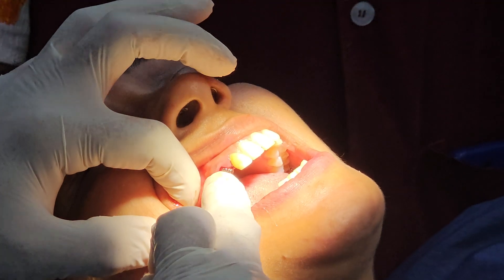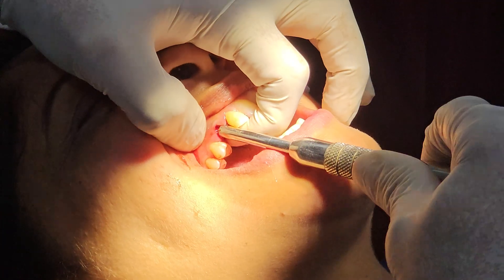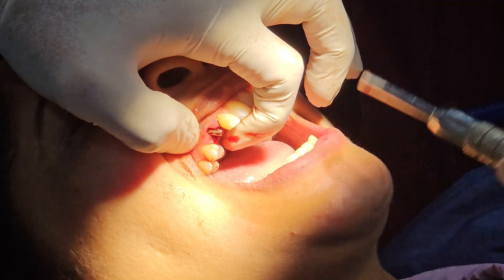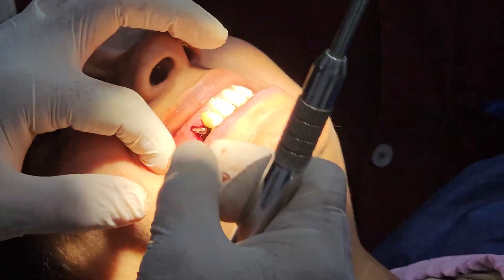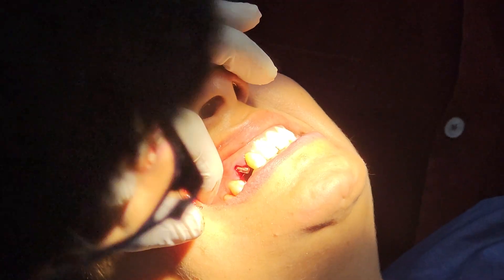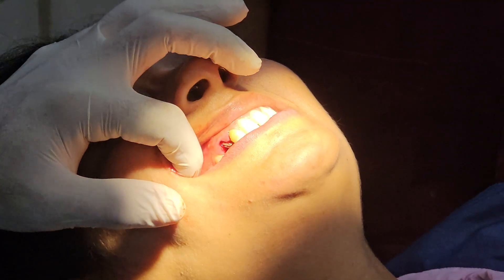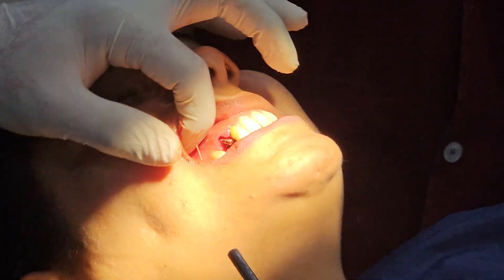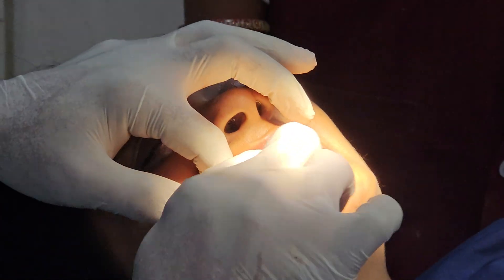This is a smooth surface implant and it does not have anti-rotational features. So we are going to give wings on both sides for the lateral and premolar region, so that the anti-rotational effect is on the crown prosthesis itself. This is how we have replaced a maxillary canine with a basal implant. Now we will take the impression and proceed with the prosthesis.